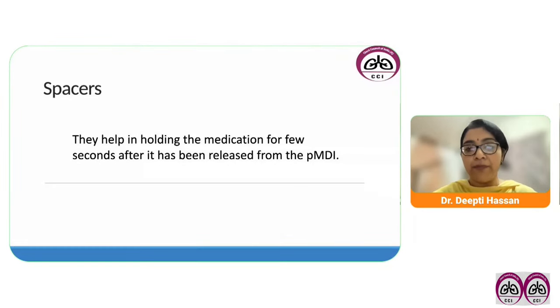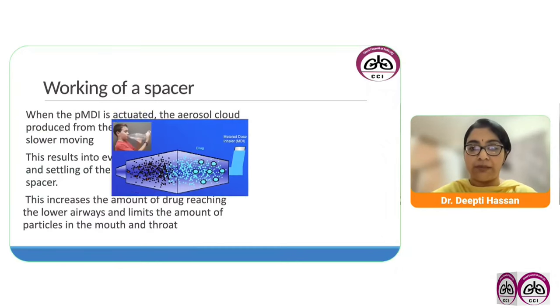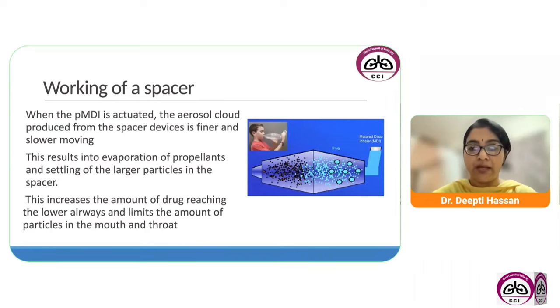So with the help of them, you can hold the medication for a few seconds in the spacer after it has been released from the MDI. So what happens when the MDI is actuated, there is an aerosol cloud which is produced. And in the spacer device, there is an evaporation of the propellant and the settling of the large particles. So it is only the finer particles which are slow moving, which move towards the mouthpiece. And then that increases the amount of drug that is actually reaching the lower airways and limits the amount that is deposited in the mouth. That is the aerosol cloud.